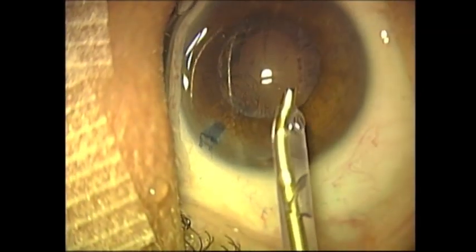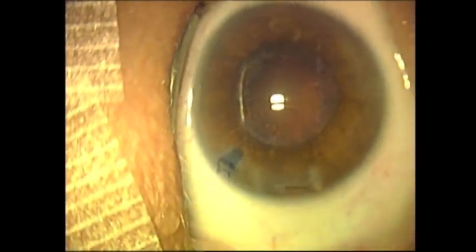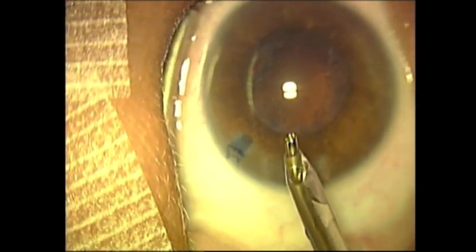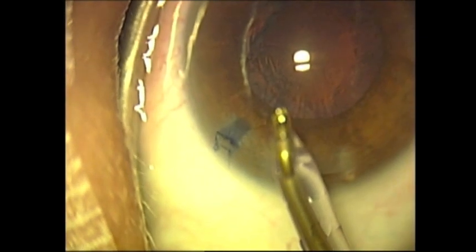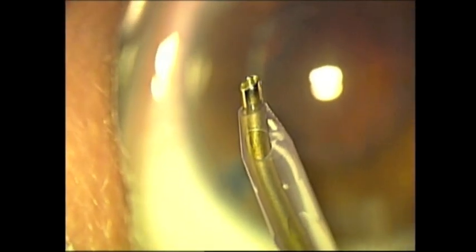We are now ready for the remainder of the procedure, but this video now concludes. One last shot of the MST Dewey Phacoemulsification Tip. Thank you.